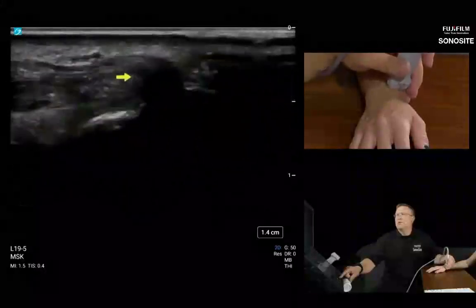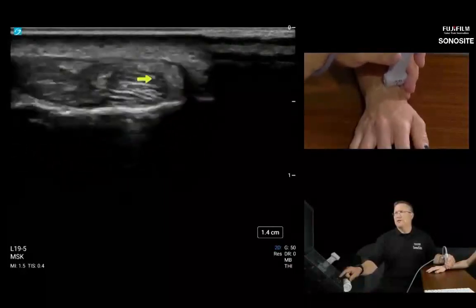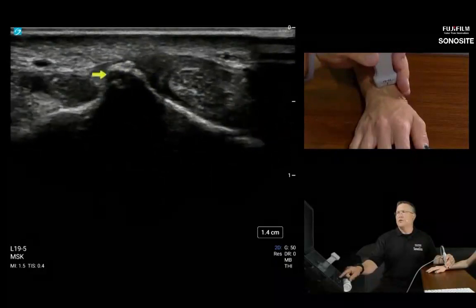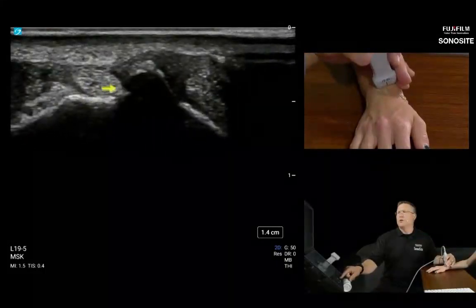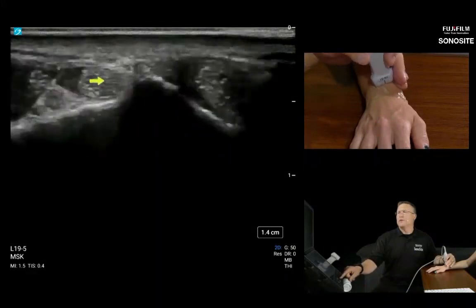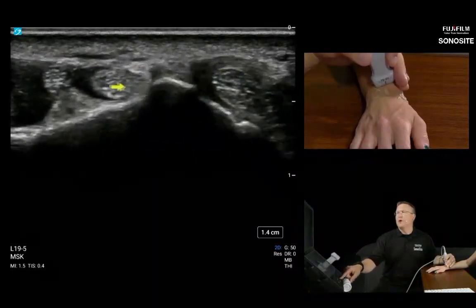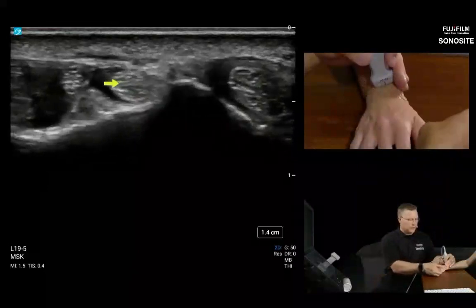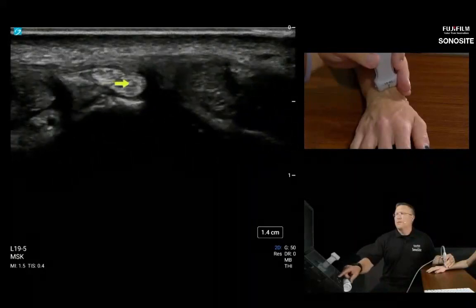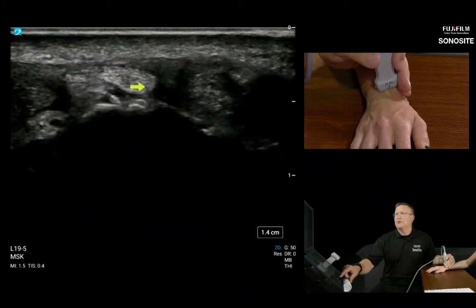A little less important now, except we do have another intersection style syndrome separate from de Quervain's tenosynovitis, where compartment number 3, let's go ulnar to Lister's tubercle. We have the extensor pollicis longus here. Let's follow it and watch it jump over compartment number 2. So when I go distally, I'm going to rotate the probe towards the thumb. I'm going to go after Lister's tubercle, following where the arrow is. Now, it's at this point I leave Lister's tubercle. You already see EPL try to jump this way.